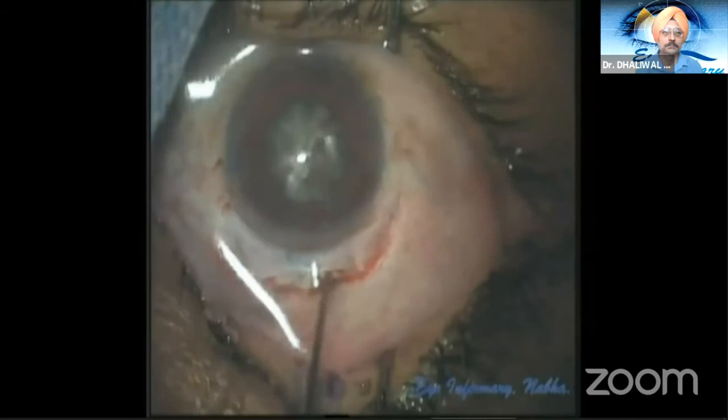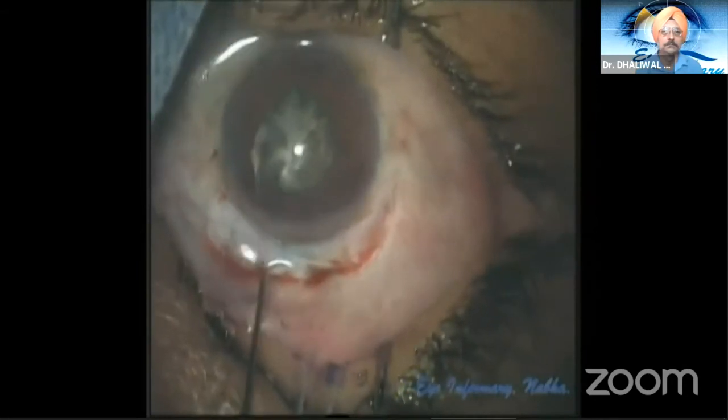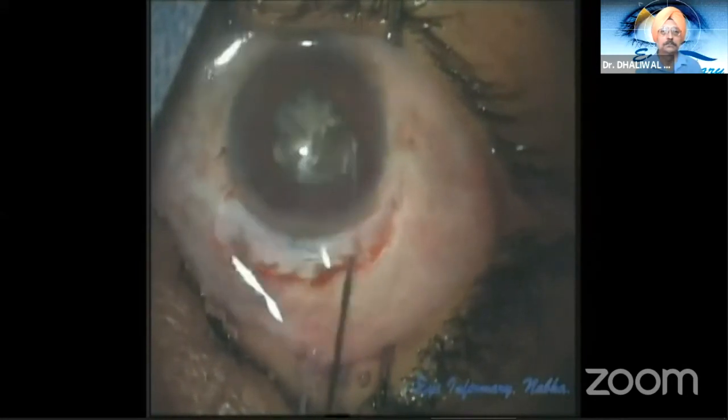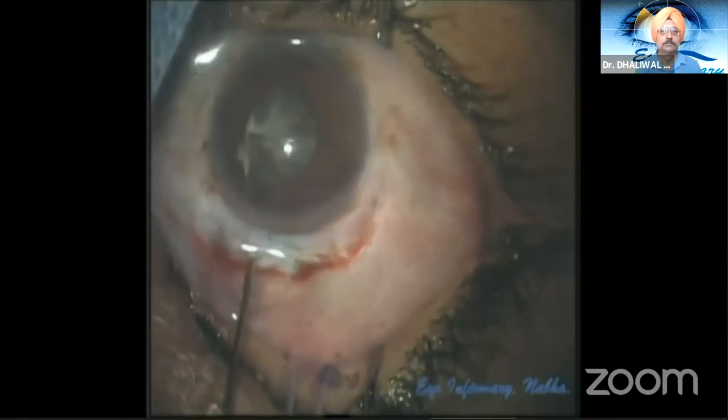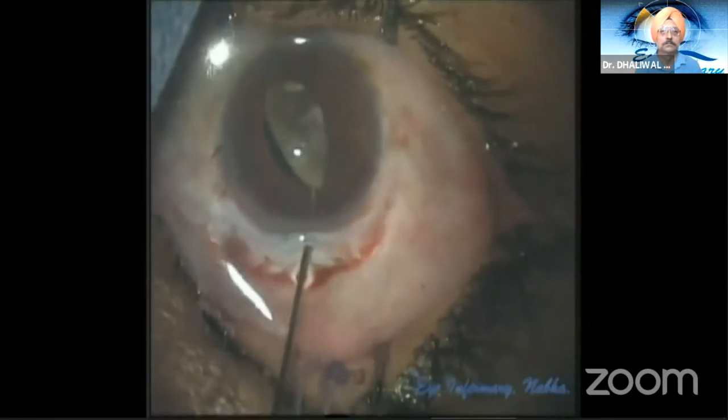The nucleus tumbling technique in real time: a gentle hydrodissection with a 26-gauge cannula, and the nucleus is tapped on the opposite side to release the trapped fluid. The cannula then flips the nucleus out into the anterior chamber partially.